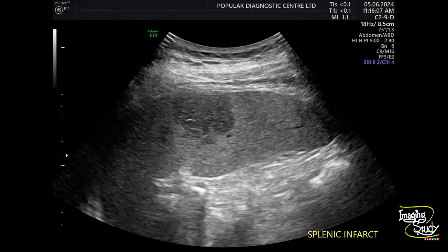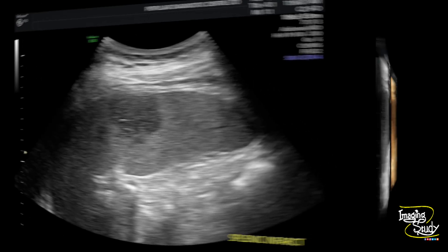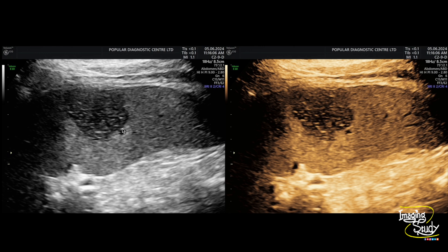The resolution or machine setup here is not optimal, so after adjusting the contrast you get this type of resolution with the same transducer and same preset. Now it looks wedge-shaped, I think.